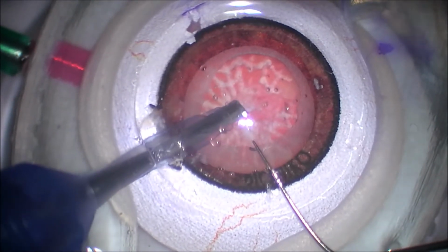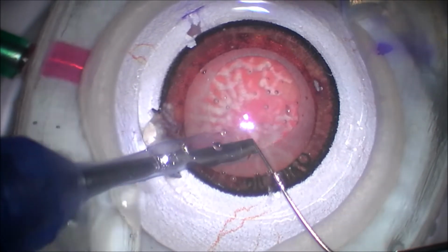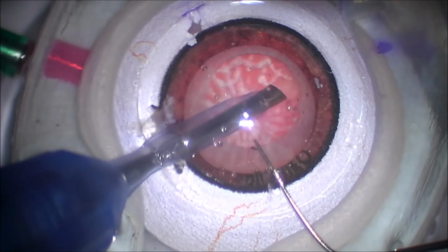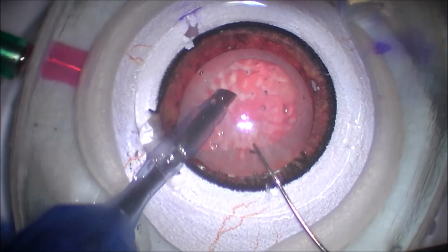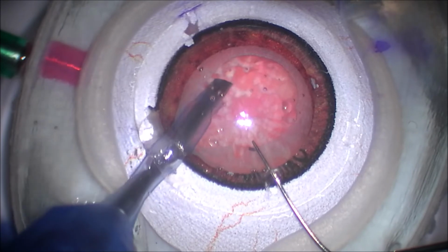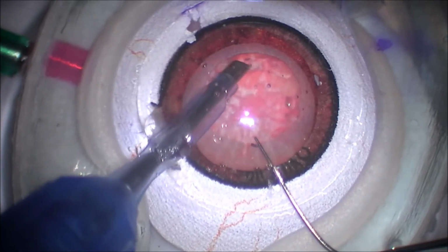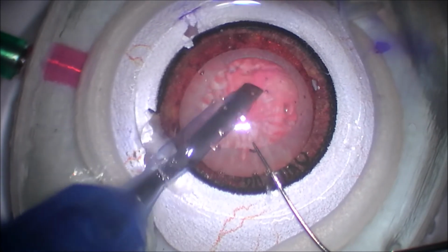But if you learn to position and pivot your instruments within the incision, then essentially you shouldn't be putting any traction on the incision. You're able to very confidently manipulate the instruments, turning the instruments to give yourself better access to the lens pieces so you can disassemble the lens, utilizing ultrasonic energy, vacuum, whatever it may be. But again, you're pivoting within the incision rather than trying to push the instruments whichever way you want without consideration of the incision.